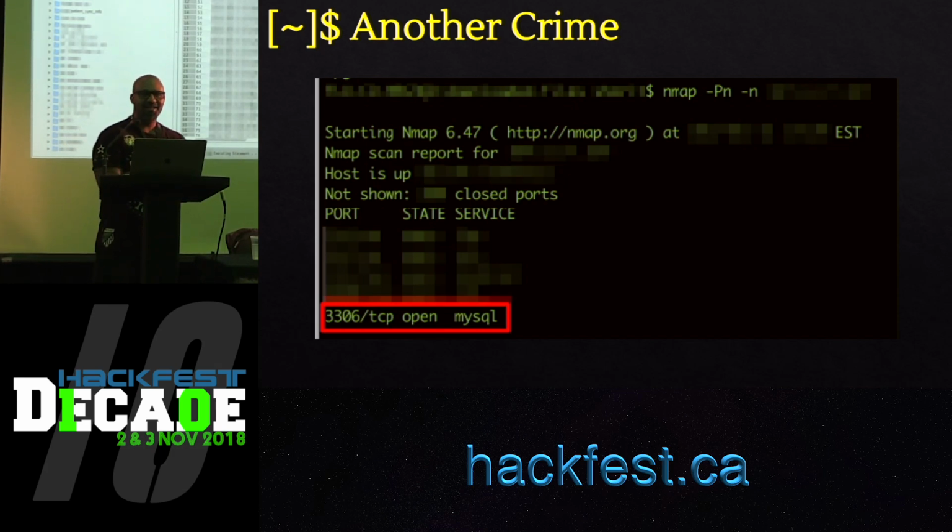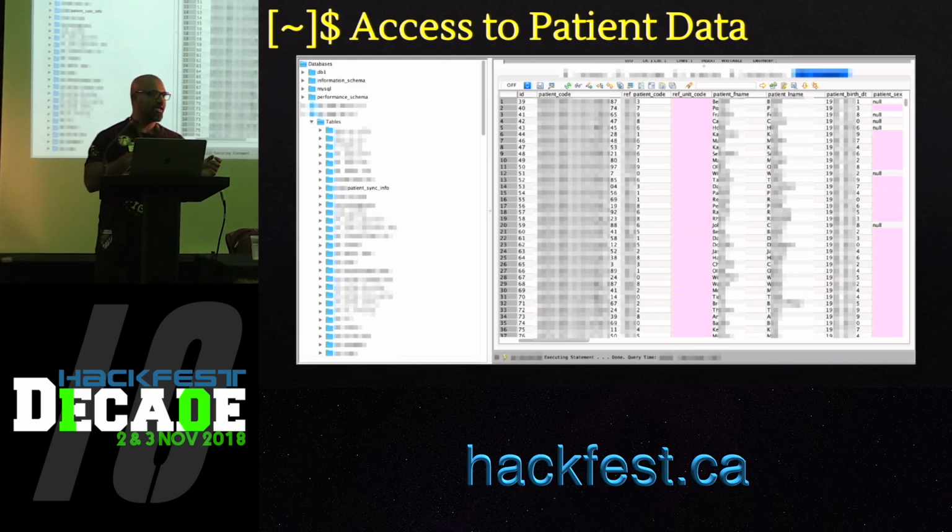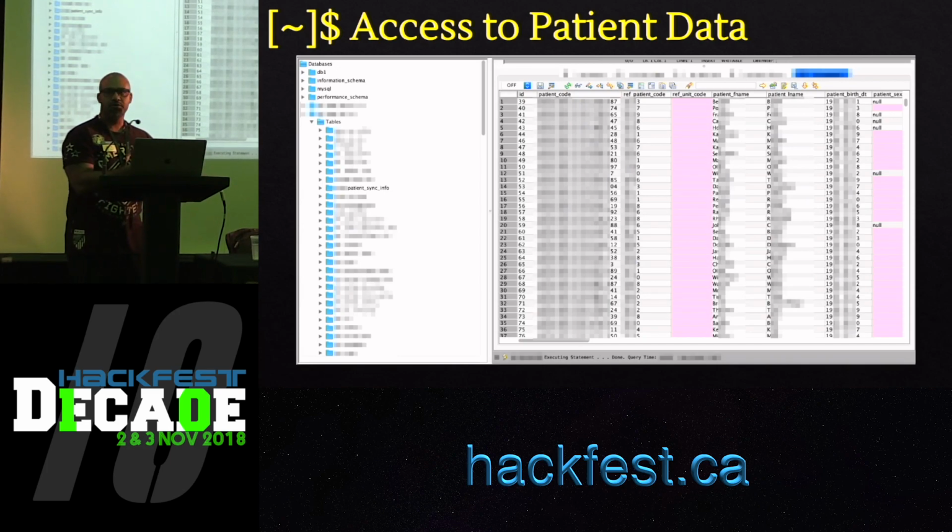And so, yeah, now we were able to connect to the backend database. Honestly, when I started looking at this device, I'm like, it looks like a small pen. In the best case scenario, I might just be able to capture some prescriptions that are stored on the device, but nothing more than that. But at this point of time, we were connected to the backend database as root, and we could access all the patient data from all the medical institutions these pens were deployed at, and not just our test pen.